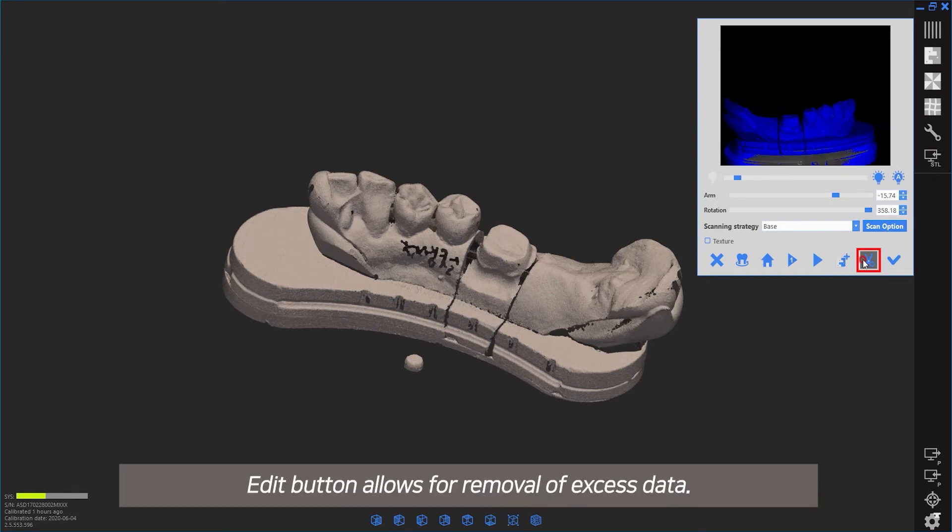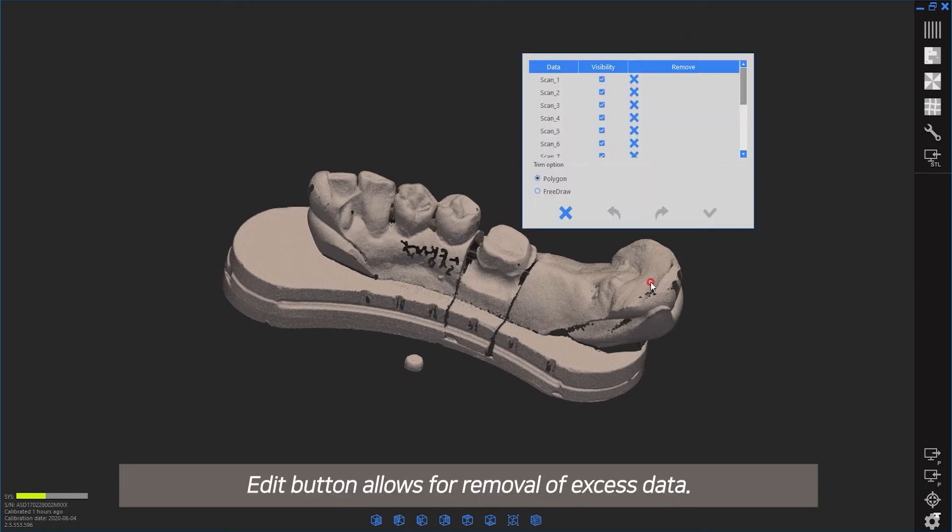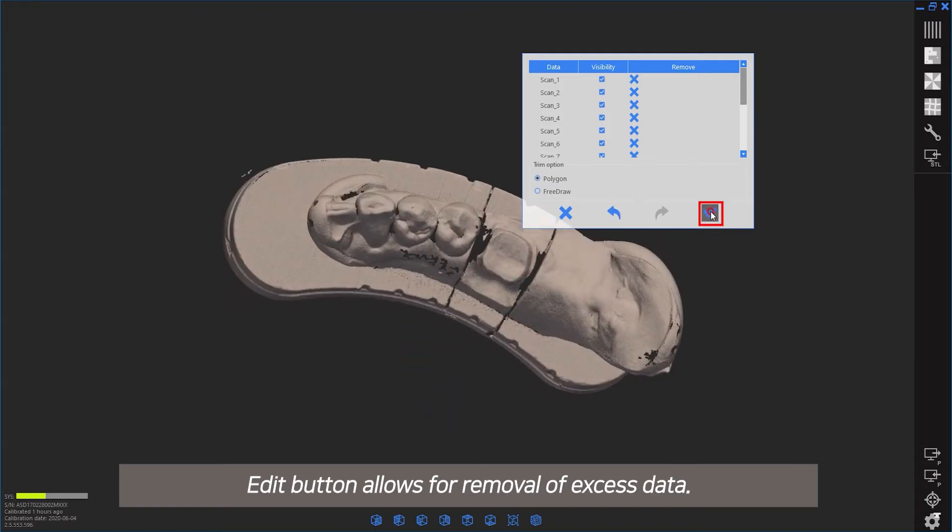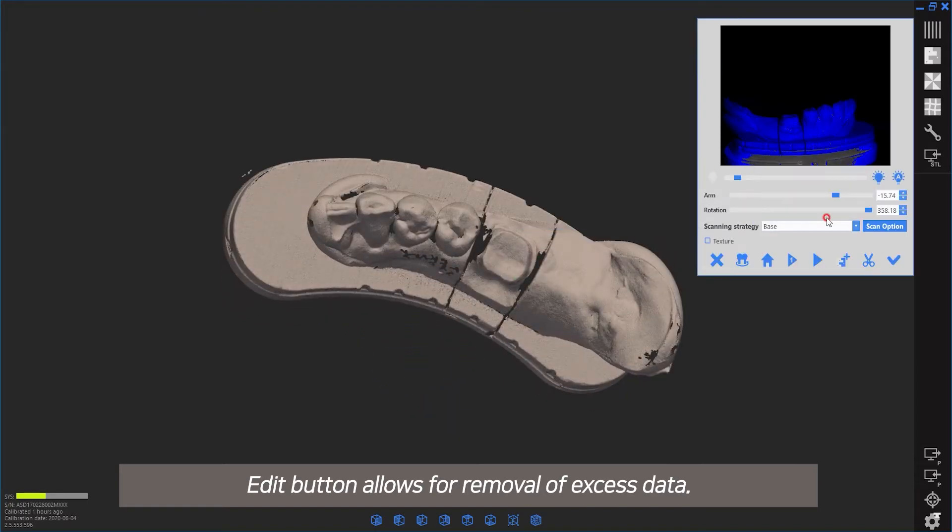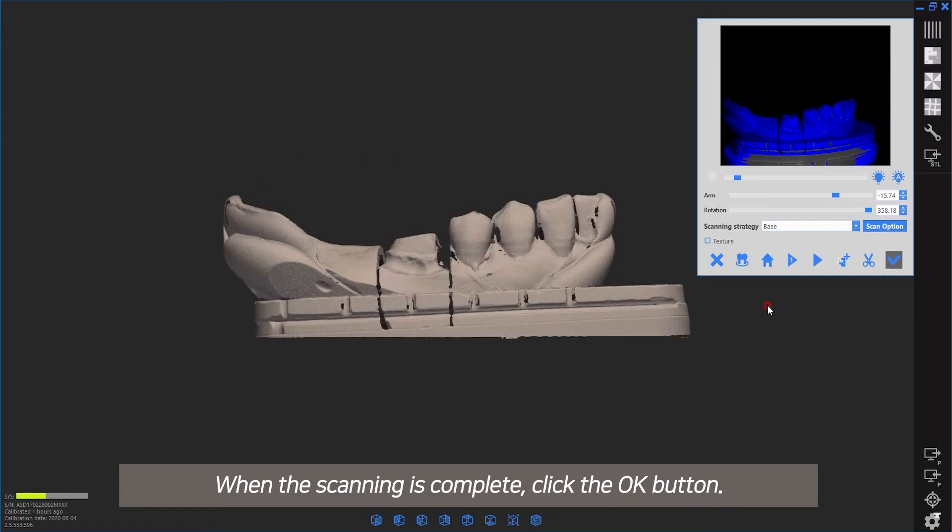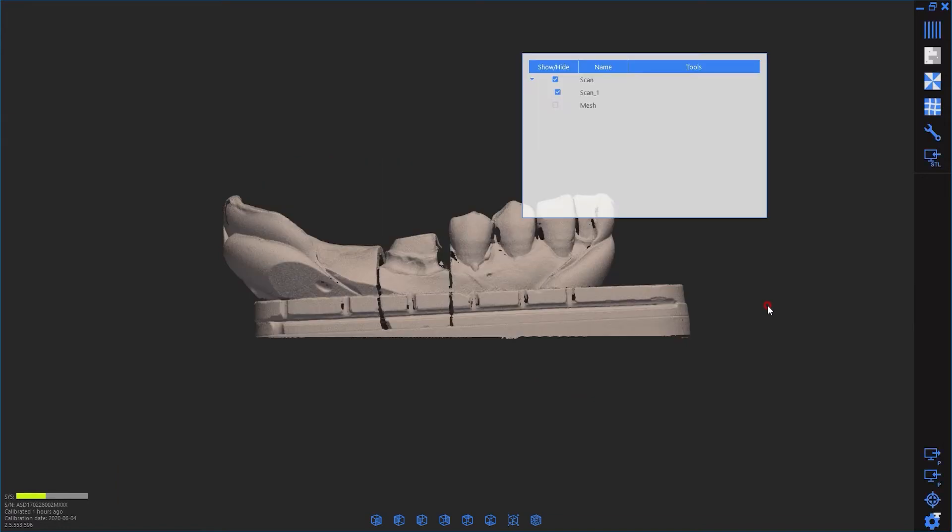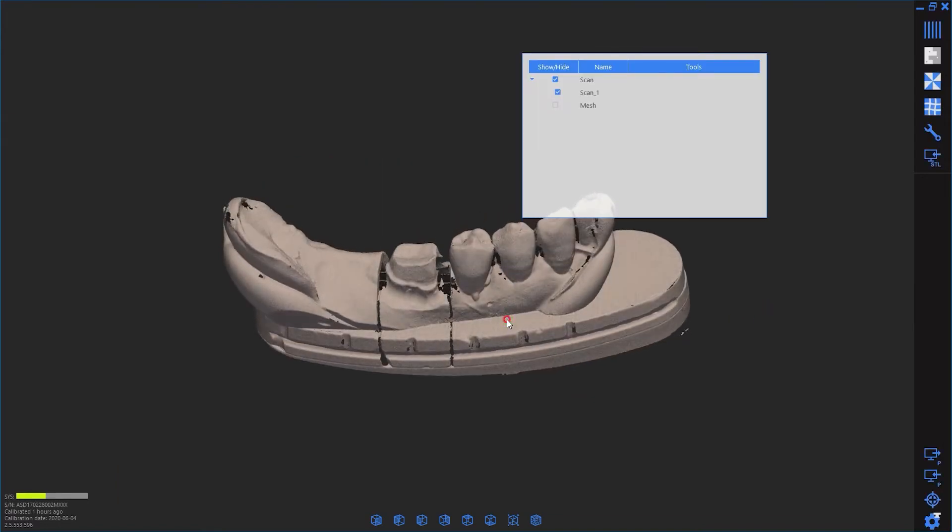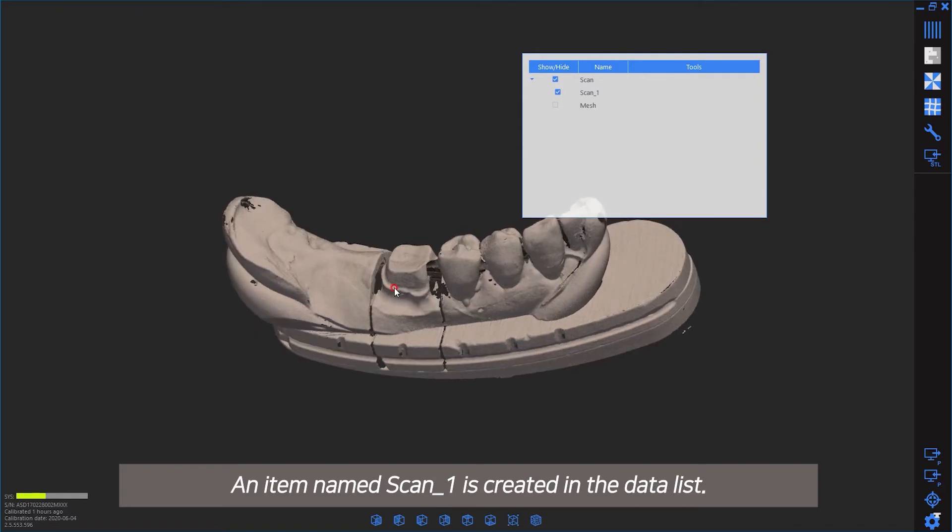The edit button allows for removal of excess data. When scanning is complete, click the OK button. An item named Scan1 is created in the data list.